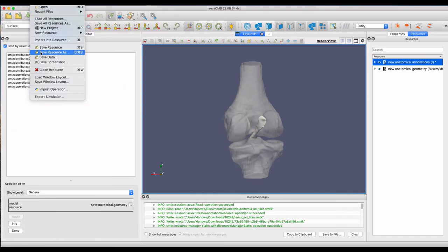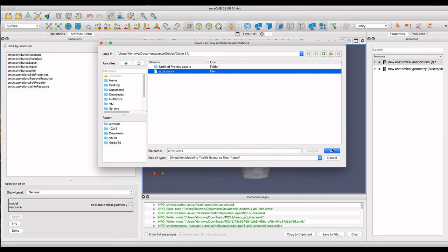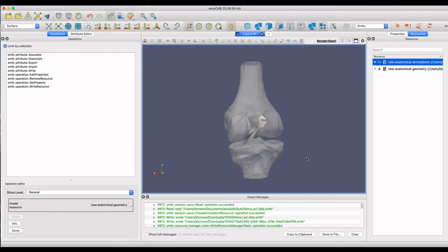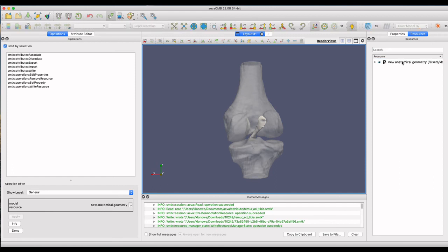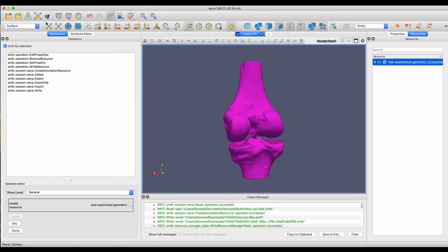After annotation is complete, make sure to save the annotation resource as it is separate from the geometry resource. Here you can see that the saved geometry and annotation SMTK files are opened separately and the new annotations are opened back up with its anatomical model.